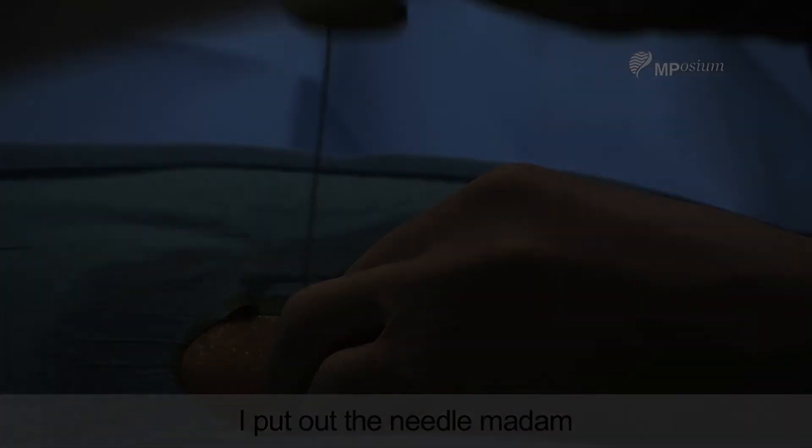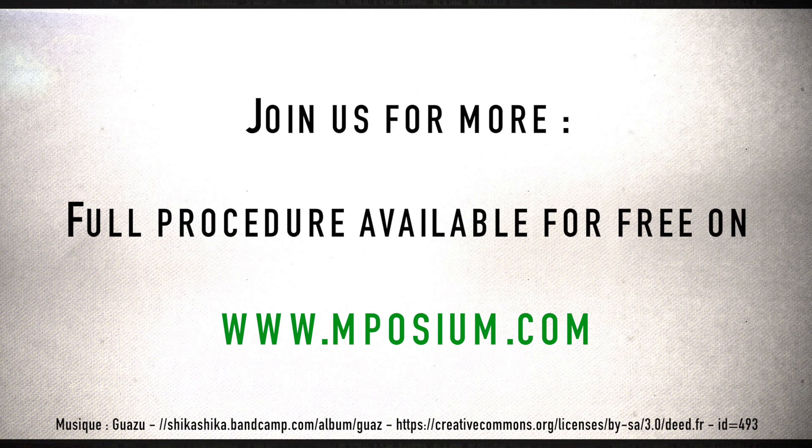I can remove the needle now, Madam. I will remove the needle. Thank you.